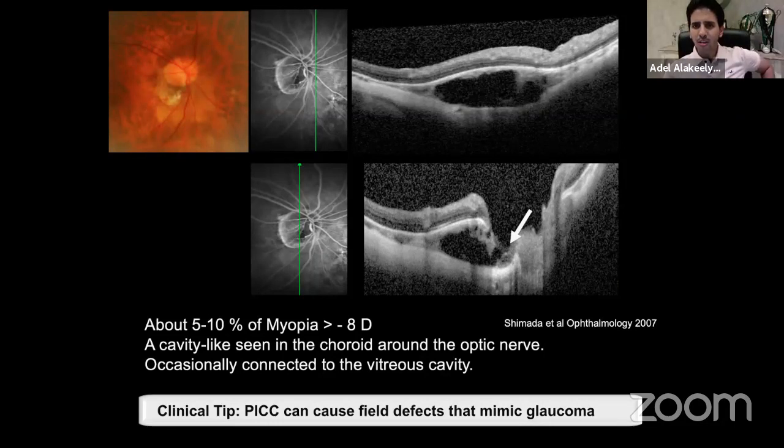A question from Dr. Asausa Noelati. She's asking about your experience of the earliest age at which the dome-shaped configuration can appear, and what's the rate of progression of the condition? Can it occur at an early age and be a predictor for large myopic progression? Yeah, thank you, doctor, for this question. I think they start to appear from the age of 40 onwards. This is the most common scenario. But sometimes you see it in younger patients, like in their early 30s or even in their 20s.